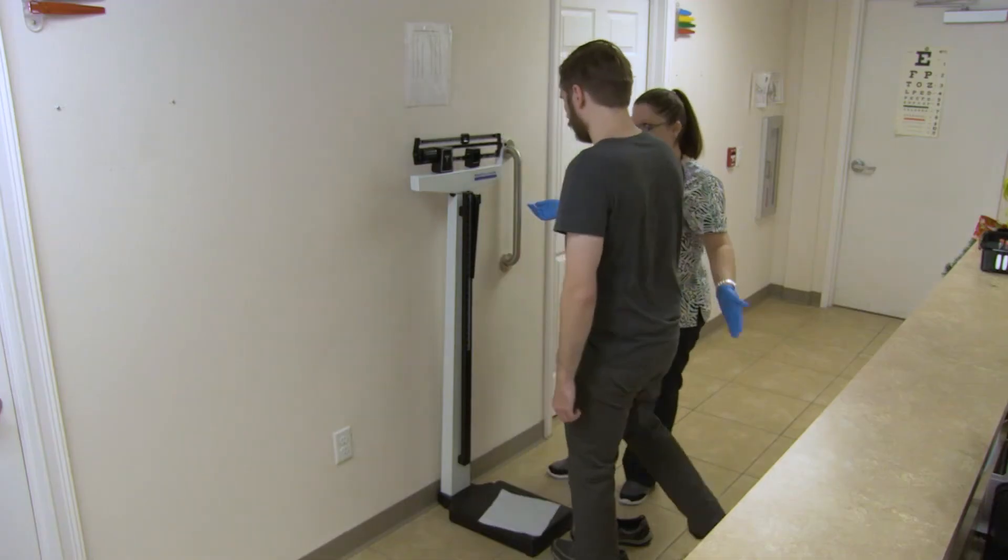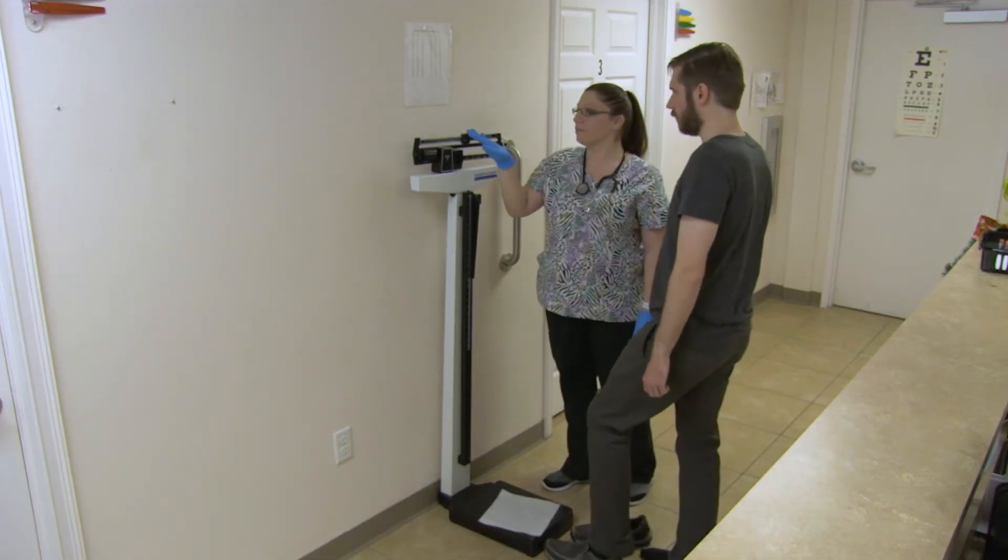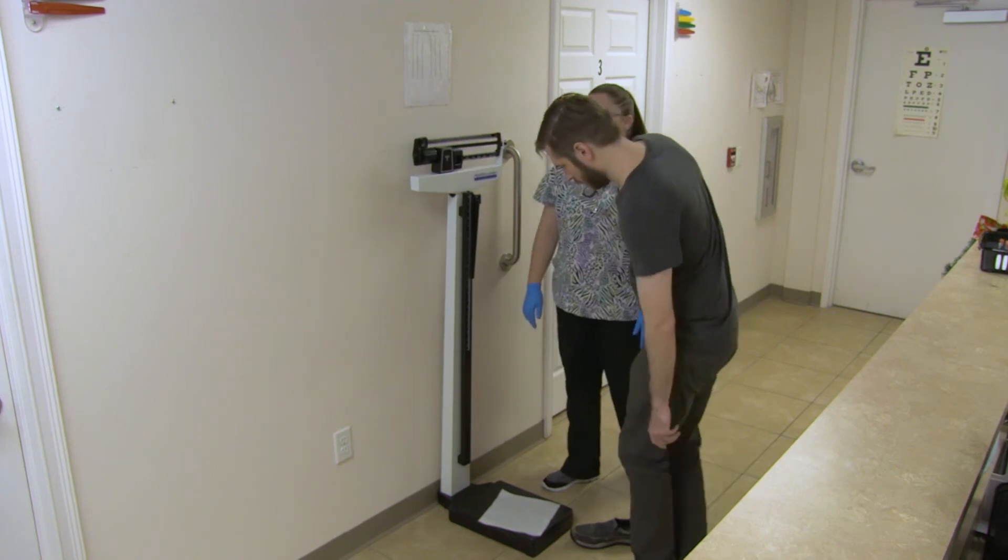Assist the patient to step off the scale, allow them to sit down, and put their shoes back on. Accurately document the procedure in the patient's medical record.